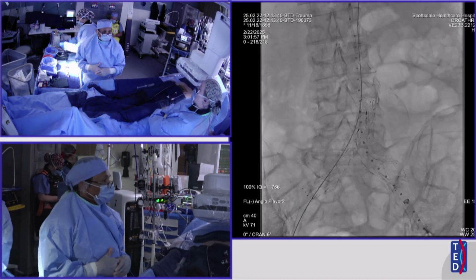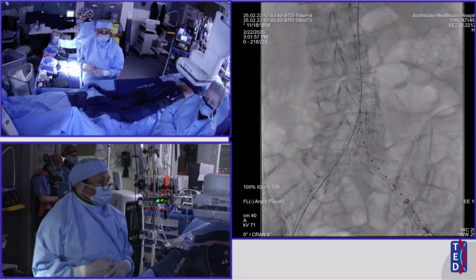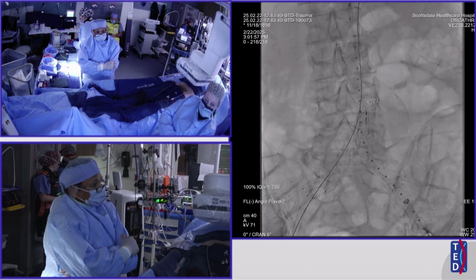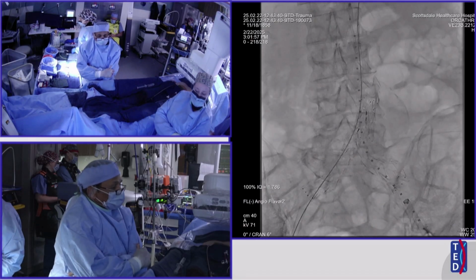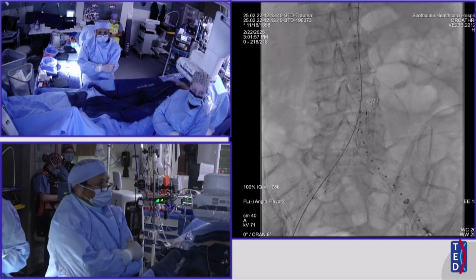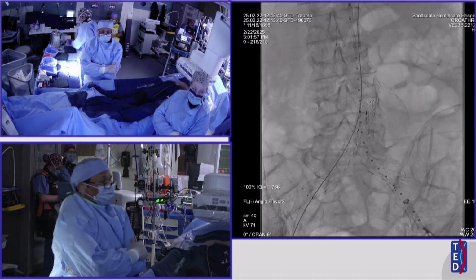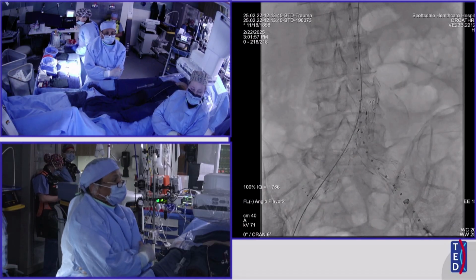So we used a 30-100 body because this left iliac caused us a lot of problems. If you look at it, it's almost like a U like this. And so on the left side, gate cannulation was easy. But putting the limbs, we had to dilate that whole thing. When you have a very tortuous but big vessel and you put in the stiff Lundquist wire, it makes it extremely difficult because you get like a pseudo stenosis. Let's play that last angiogram again.